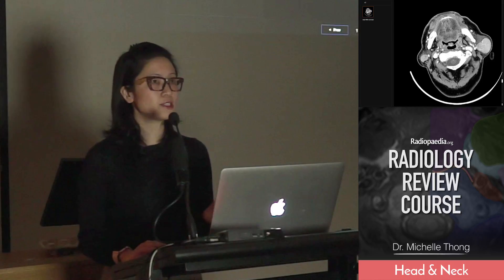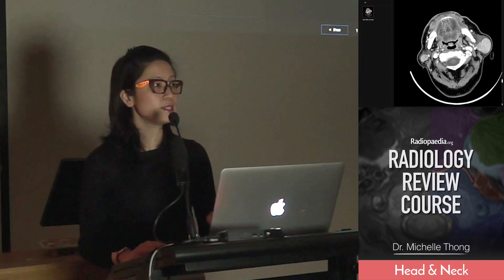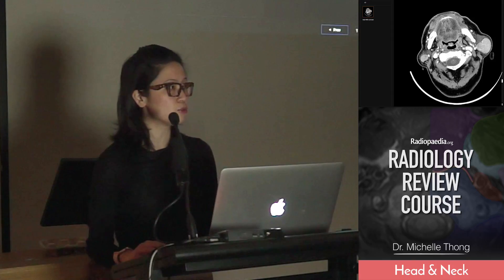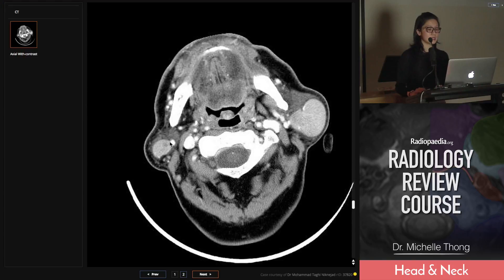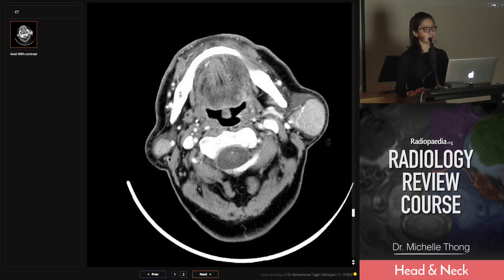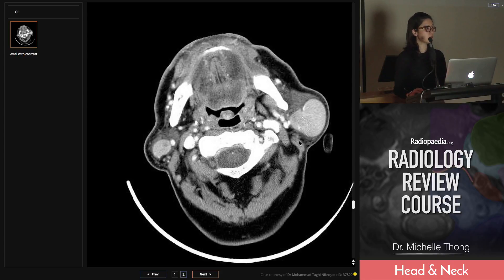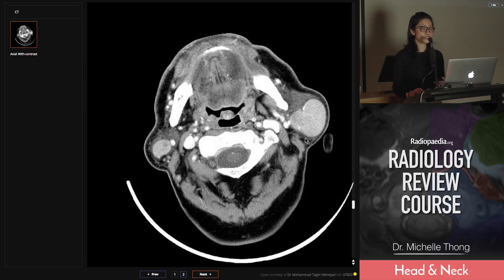The parotid gland contains normal intraparotid lymph nodes — please don't call them lesions if they look like normal, non-enlarged nodes. These, however, are large masses and they're very solid. They're both in the superficial parotid, but posteriorly they're both in the parotid tail. The most common differential will be a Warthin's tumour, which can be multicentric — either unilateral or bilateral in about 20% — and is often associated with males, slightly more elderly, and with a history of smoking or irradiation. They are benign lesions though.